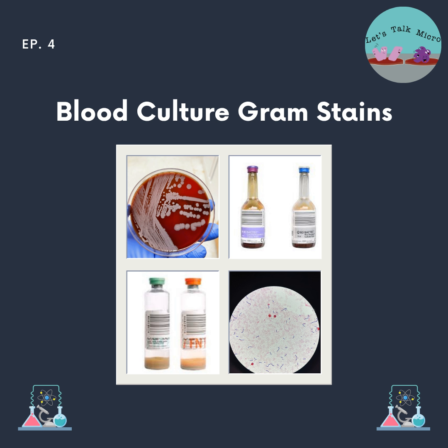They have different components. The anaerobic bottle helps the anaerobic organisms grow in there. However, aerobic organisms can grow in the anaerobic bottle. As you know, most organisms are facultative anaerobes, so they can actually grow in anaerobic conditions. And these bottles are manufactured by different companies. You have BD, you have bioMérieux, no affiliation to the podcast, of course. And they also provide the instrument where you incubate these bottles.